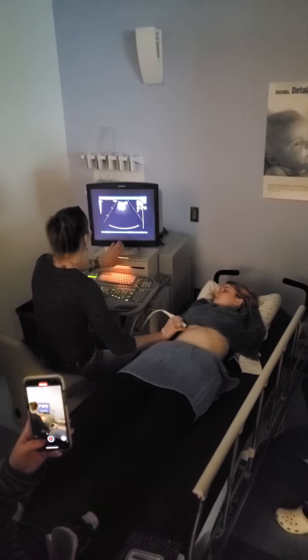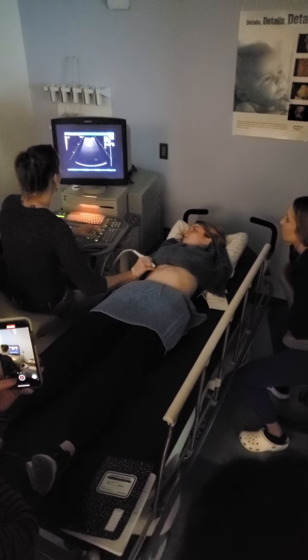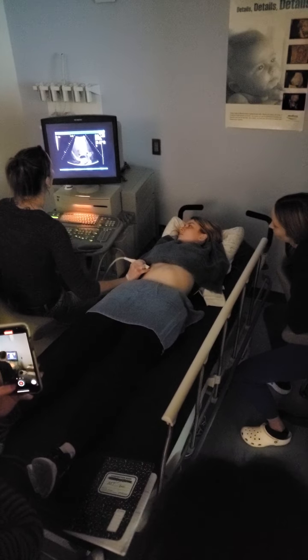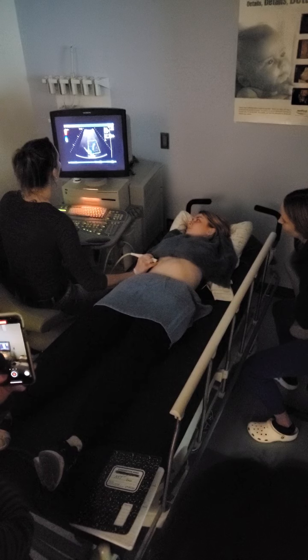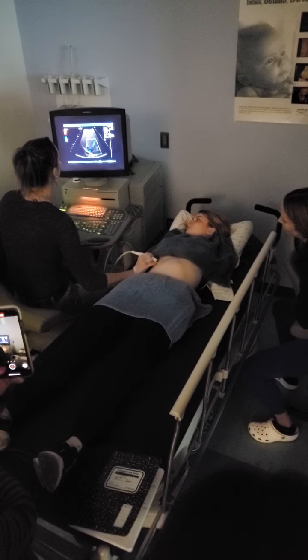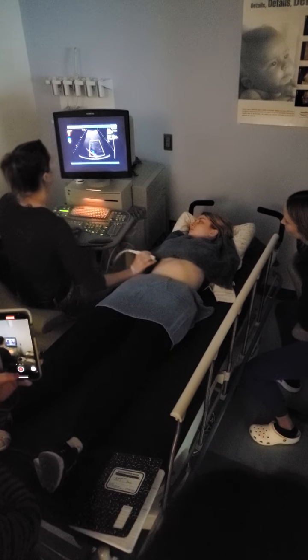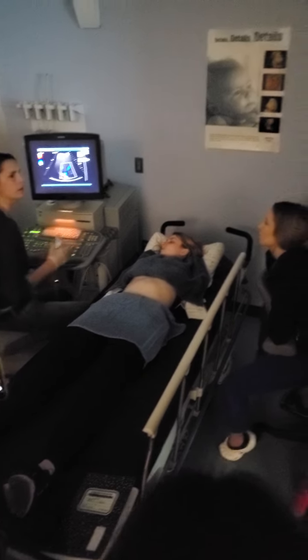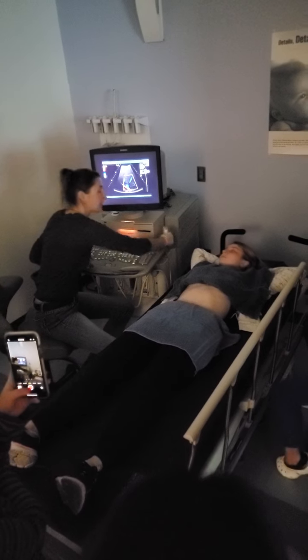Okay, so next up, same window or maybe a little rib space up. Get down here again. I can angle up and I can get those hepatics. So I can throw color on those hepatics. Now, we expect these to be blue, right? But sometimes they'll be red. Why is that? Did you guys learn about hepatic Dopplers in class? Yeah. Okay. We'll listen to it here in a second.